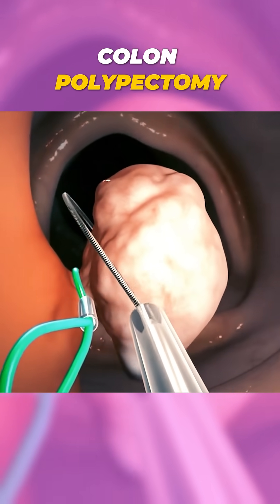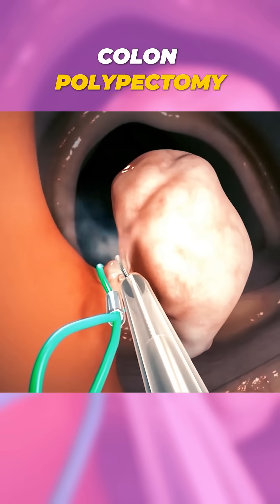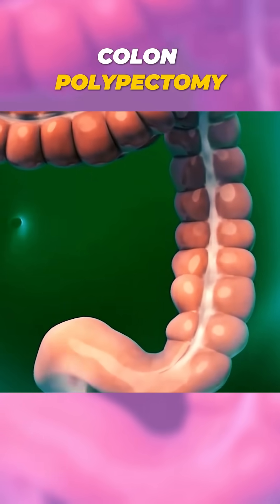Fun fact: most polyps are harmless, but removing them early can prevent them from turning into something more serious later. It's like catching a potential issue before it even has a chance to become one.